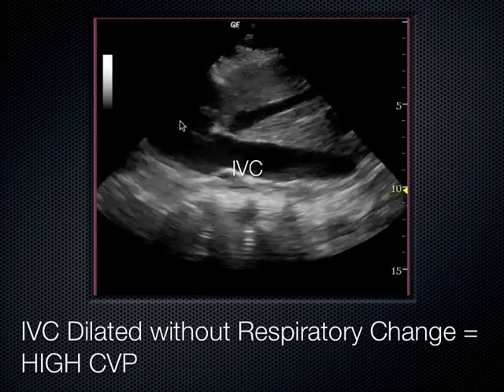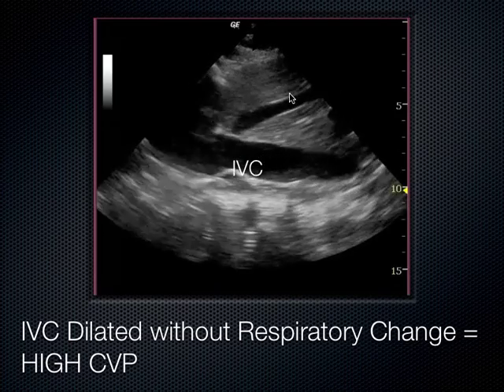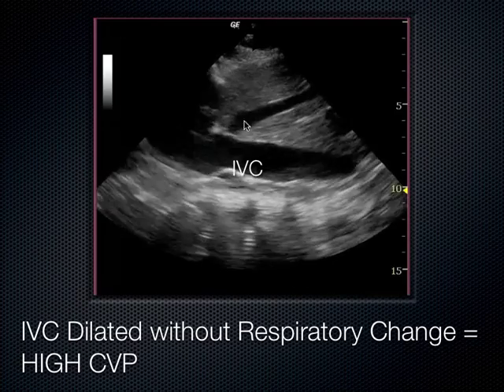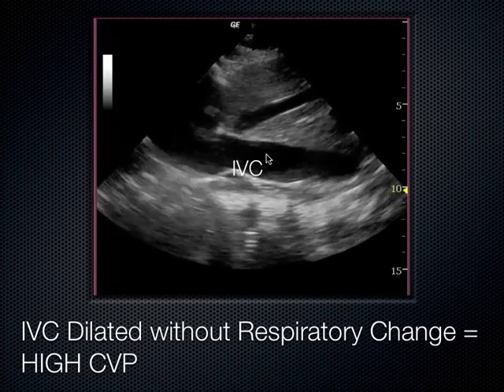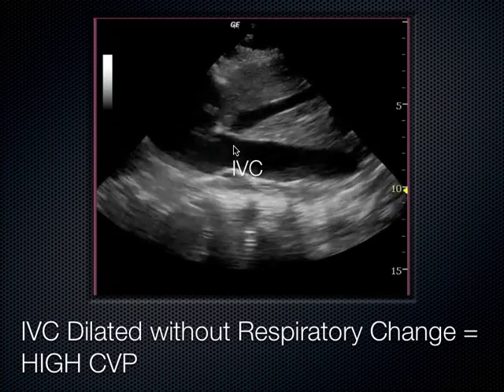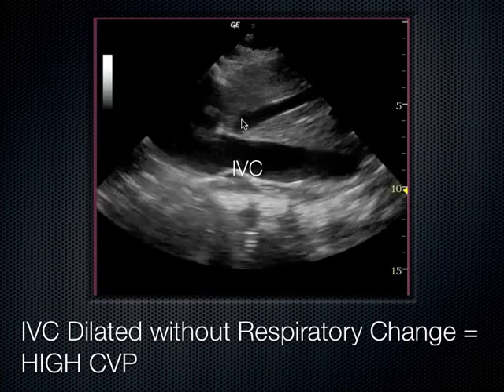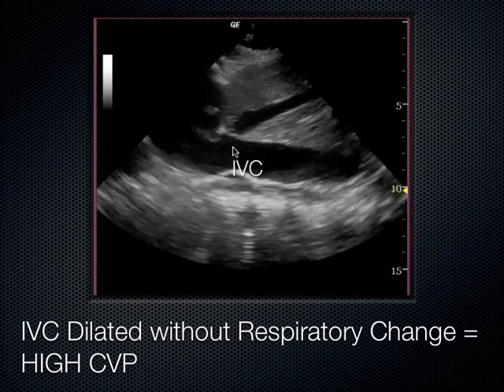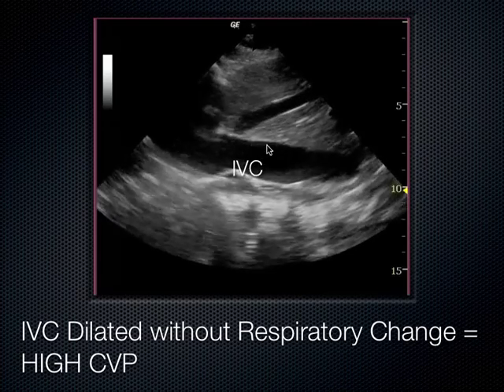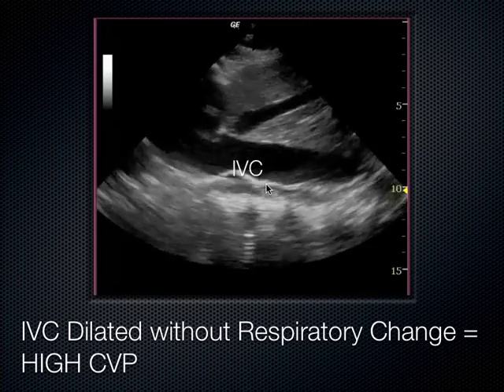This is the heart right here. This is the right atrium of the heart. Here's the IVC coming across the screen underneath the liver. This is the hepatic vein right here. People always say, well, where do I measure the IVC? Over here, over here, over here. Hotly debated topic. Probably 2 centimeters distally to where the hepatic vein dumps in to the IVC. So that would be maybe around here is where most people agree to measure the IVC diameter.